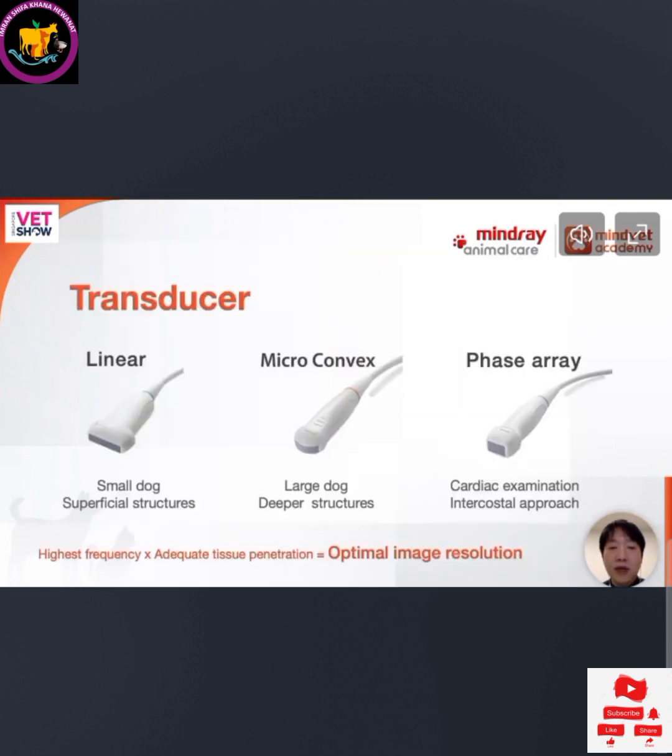When performing abdominal ultrasound in dogs and cats, the transducer should have a frequency range between 5 and 18 MHz. The linear transducer is the best suited for imaging superficial structures and small dogs and cats due to its high frequency, which provides a high resolution image. However, high frequency ultrasound waves cannot penetrate to the deeper area.